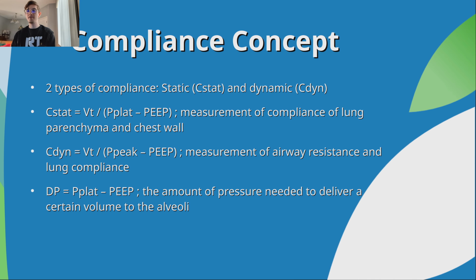And then finally here we have my favorite, driving pressure is plateau minus PEEP. This is the actual amount of pressure needed to deliver a certain volume to the alveoli. And real quick, something I want to mention while we're here, when we are talking about something being quote-unquote lung protective, we are always talking about plateau and driving pressures.